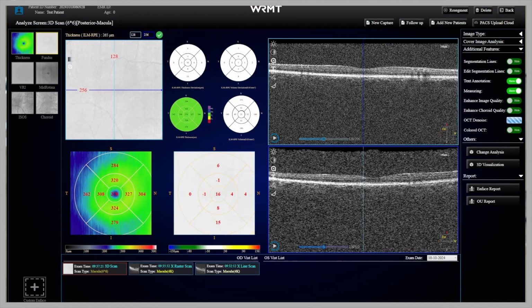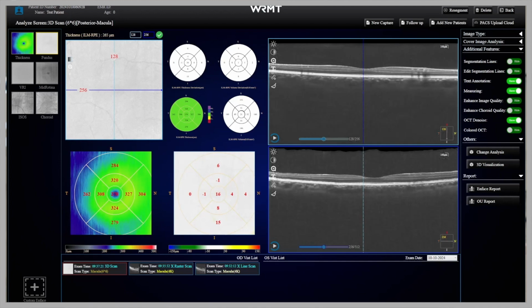In this examination, I can see some measurements, the measurement maps of the thickness of the retina. I have here 4 maps. One is for the retina thickness and retina thickness deviation, and here is the volume thickness and the volume deviation. As you can see, it has a color code, so based on the normative database of the device, it shows you if the range of the thickness is within normal limits or not.